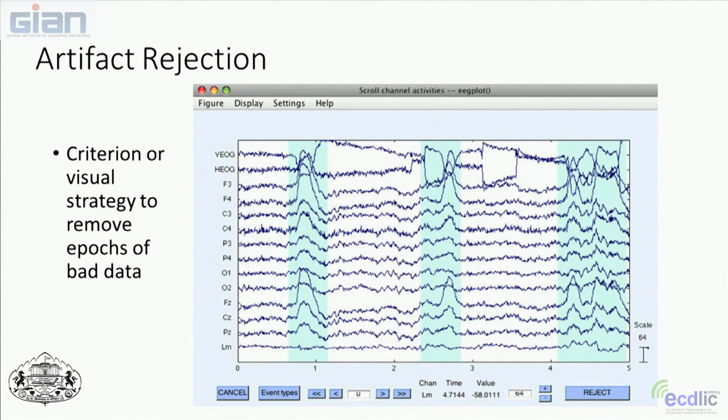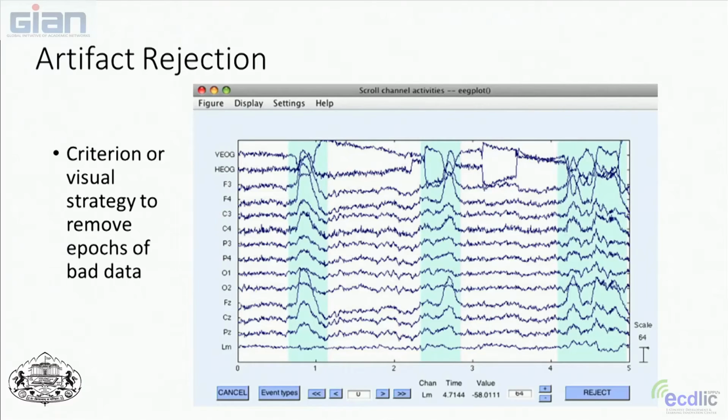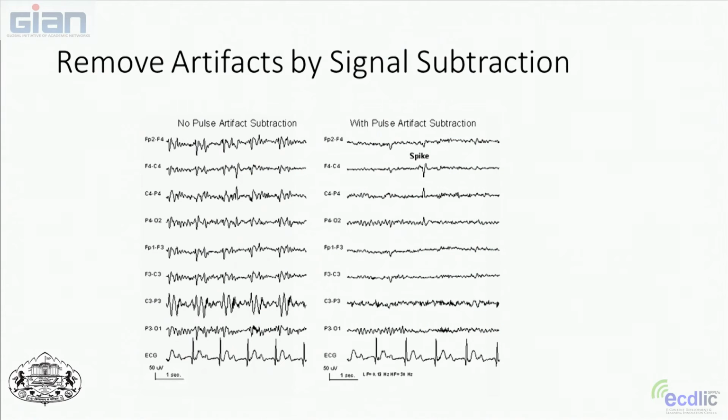We'll talk about sleep a little bit more today, and we'll talk about it in detail, but you can recognize based on the EEG signal, based on this slow wave activity and different features that you see in the EEG, what stage of sleep somebody is in. And as they're doing this, they can pick up where they see these noisy regions of activity and just select them and remove them. Of course, then you're getting rid of some of your signal, so you're not quite sure what's going on during that time period. So that's not really an ideal way to do it.